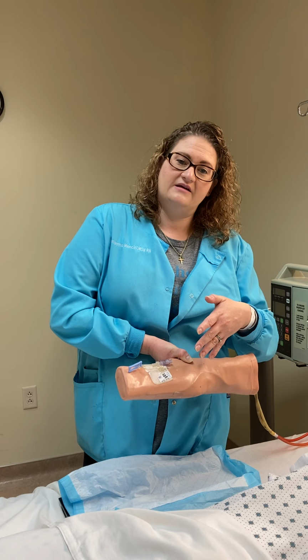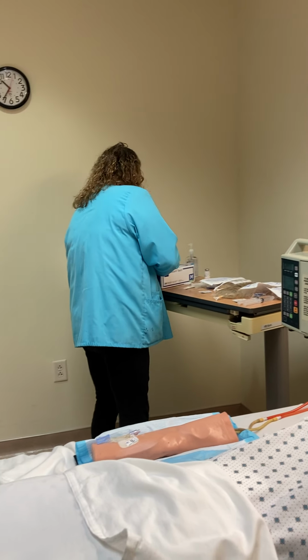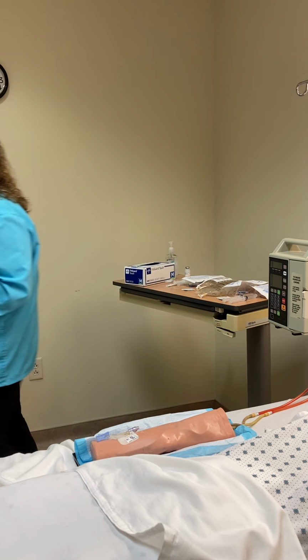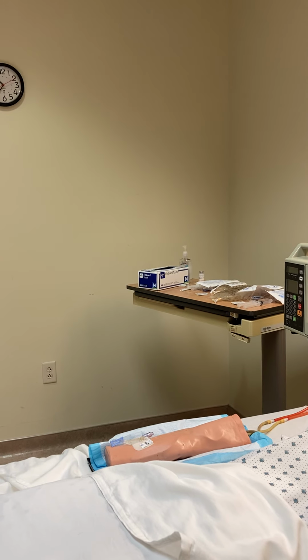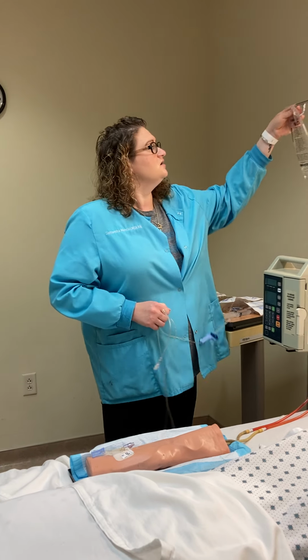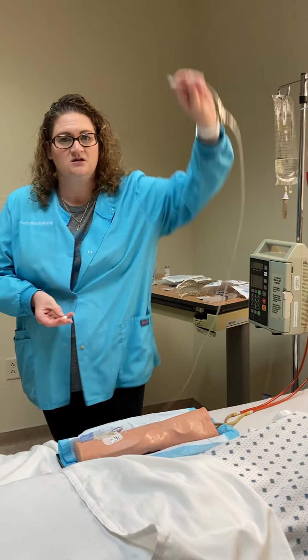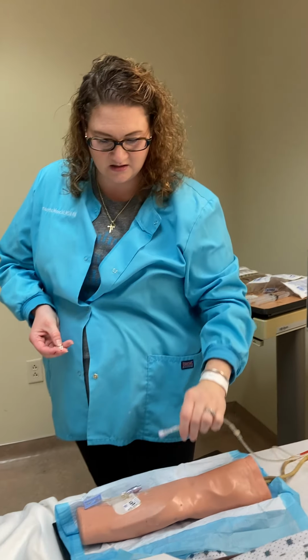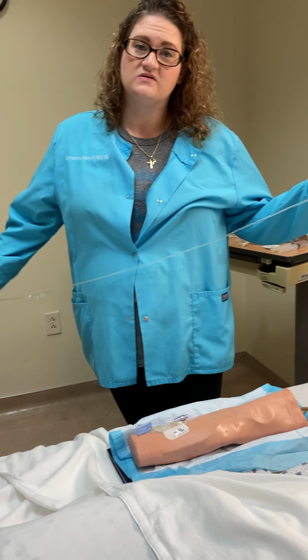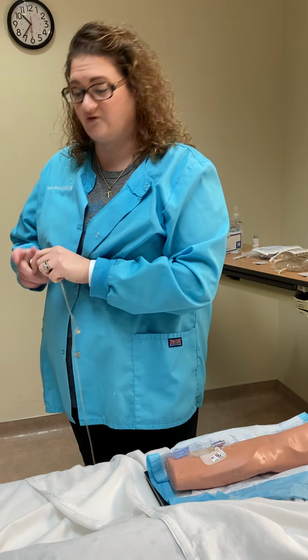And then also if lines are disconnected. So if we have a line that is disconnected and it doesn't have a cap on the end of the line, we would need to say it's like this, just disconnected, laying in the bed, or it fell on the floor. We're not going to use the line, okay? We would have to get a whole new setup because we don't want to set our patient up for infection.